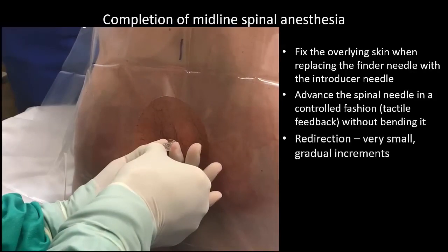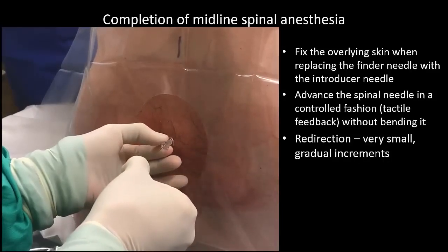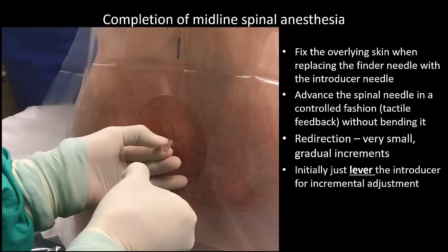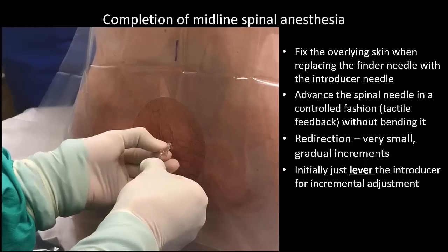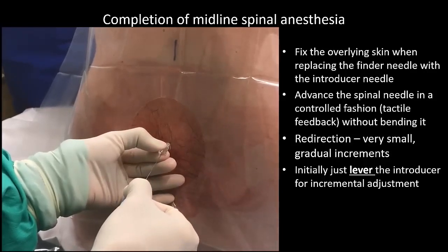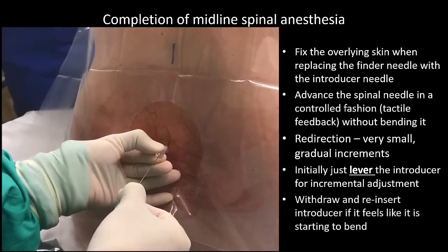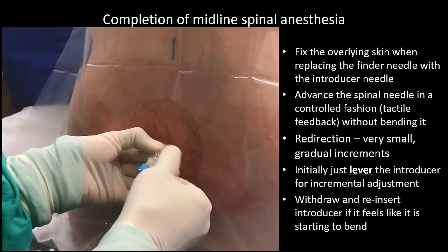When bone is contacted, very small cranial redirections are made. The tip of the spinal needle must be withdrawn out of the tissues and into the introducer before the introducer is manipulated, or else the spinal needle will just bend. To keep the angle small, just lever or joystick the introducer without withdrawing and reinserting it. You can easily get 5 to 10 degrees of change in this way. Only withdraw and reinsert if you feel that the introducer is starting to bend and that you need to create a fresh needle track in the tissues.